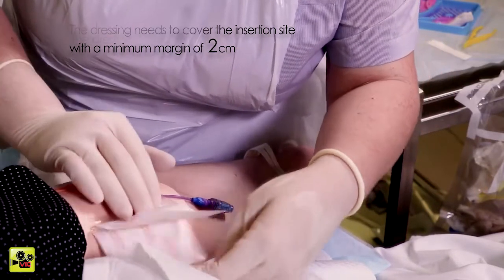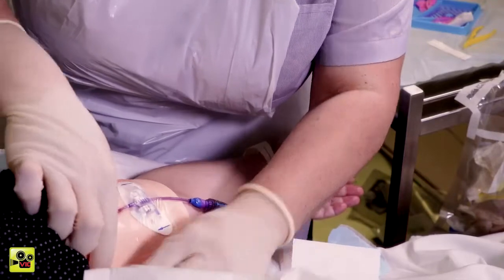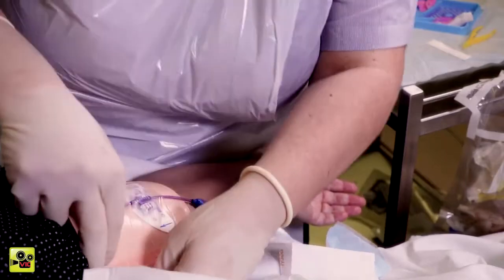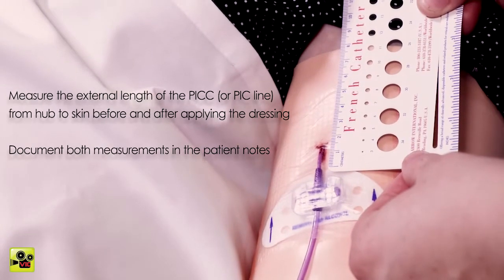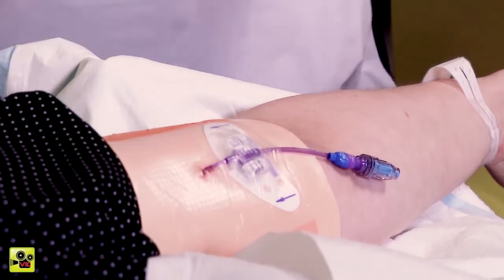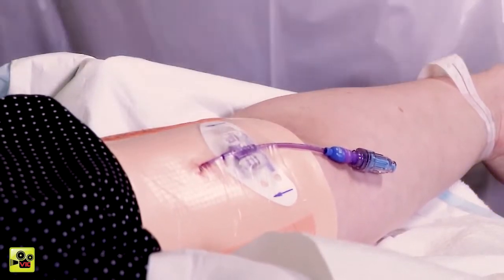Is that okay? Not too tight? No, that's perfect. I'm just going to put the date on there just to remind you when it needs to be changed again. Oh, okay. Thanks so much, Jane. You're very thorough. Thank you. There we go, Vic. All done.